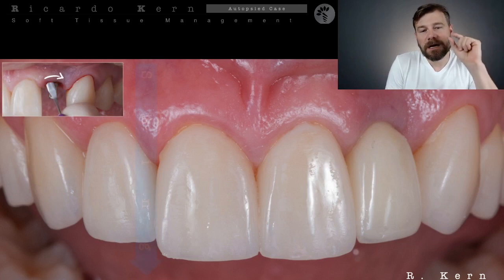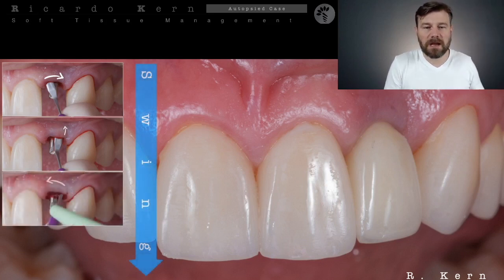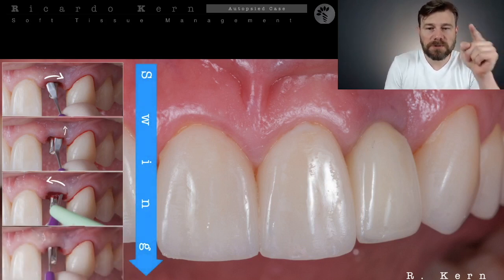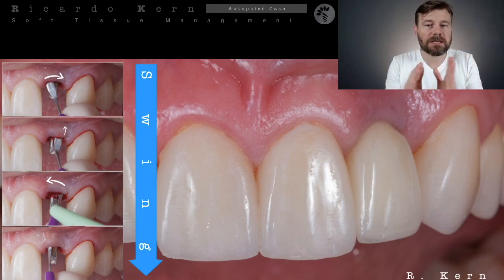I'm talking about different ways to split or prepare the keratinized area and, apical to that, the mucosa area. We treat these two different tissues, okay? You can choose to go to a full thickness flap. This is your option. My option usually is to split this area.